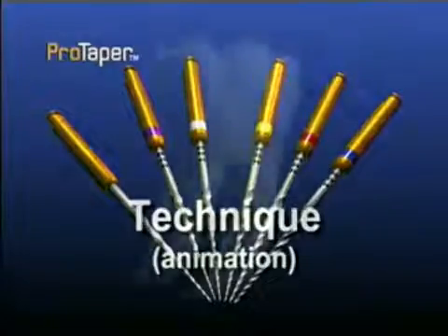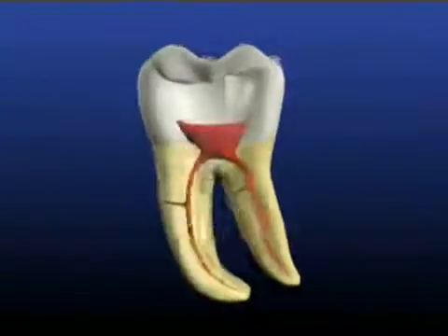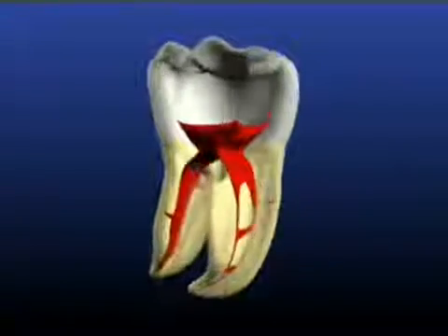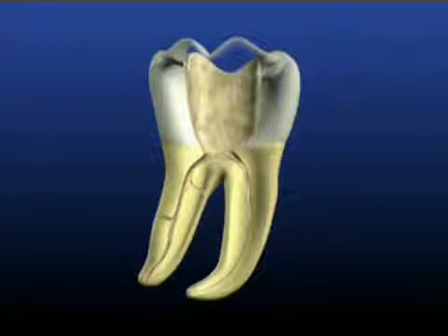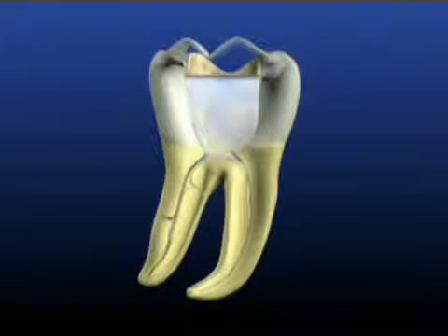The following animation will demonstrate the instrument sequence in a calcified and moderately curved canal. As with any endodontic technique, good straight line access to the orifices is necessary. Following access, the pulp chamber is filled brimful with either sodium hypochlorite or a lubricant such as ProLube. We will focus our attention on a single canal in this animated lower molar.